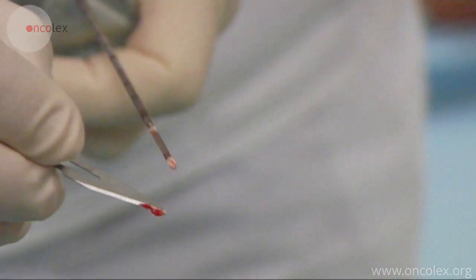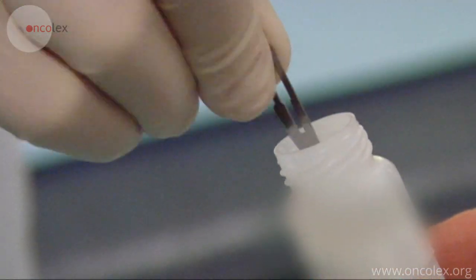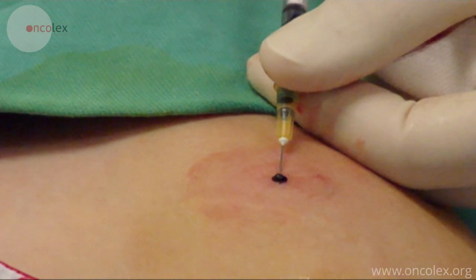The biopsy is placed in Ringer's solution and sent to the pathologist. Finally, the puncture point is tattooed so the biopsy canal can be easily identified.